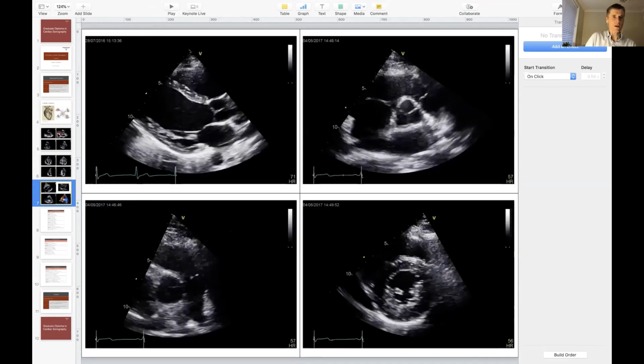And then lastly, the aortic valve. Let's have a look at that. Well, the aortic valve is one that you see particularly well from parasternal views. You can certainly see the aortic valve here. We can see the right coronary cusp and the non-coronary cusp here. We can see all three cusps here, and importantly, we can see the annulus, and that's another important feature to appreciate. With certain diseases there can be significant calcification of the aortic valve annulus and the leaflets. It's important too to be able to recognize the different cusps.